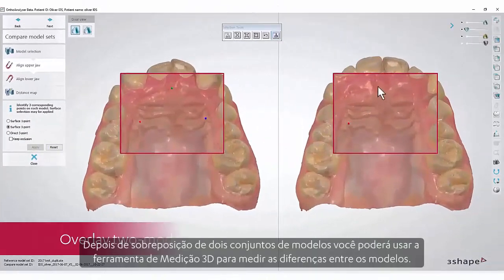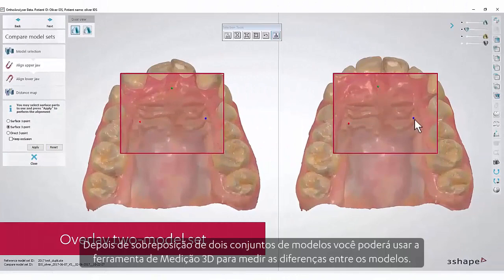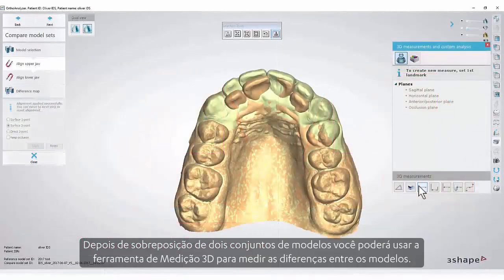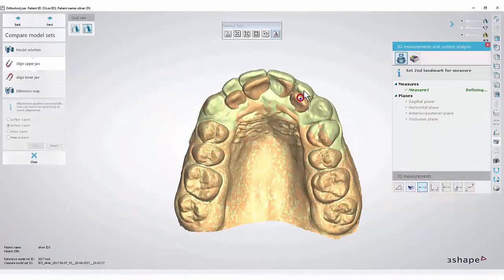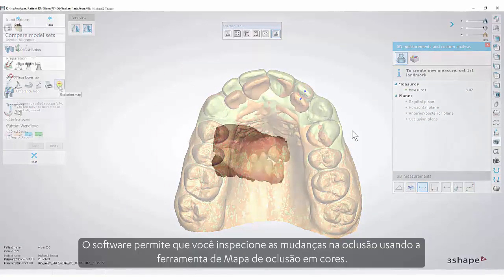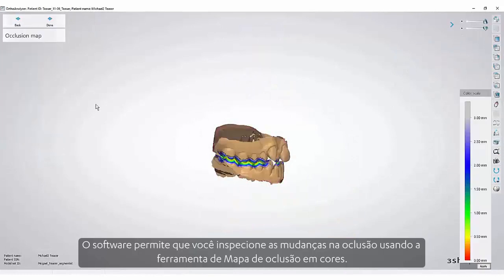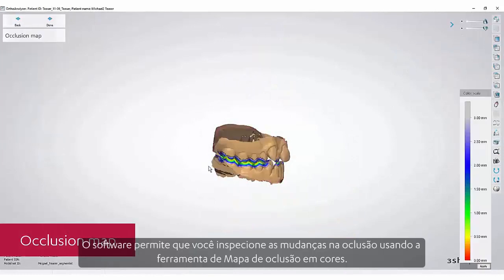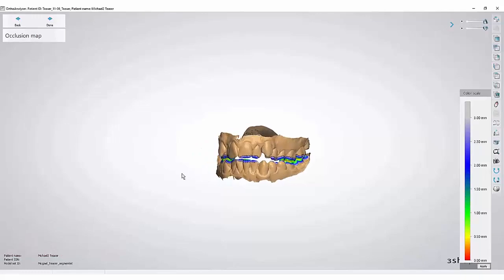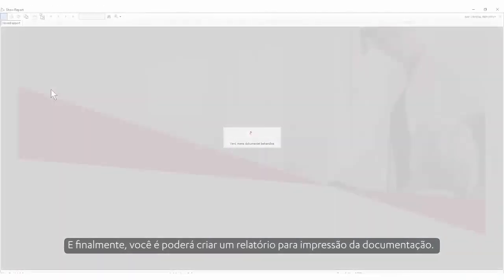After overlaying two model sets, you are able to use the 3D measurement tool to measure the differences between the models. The software enables you to inspect the changes in the occlusion using the colored Occlusion Map tool.